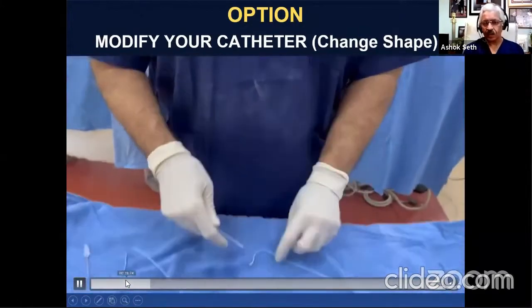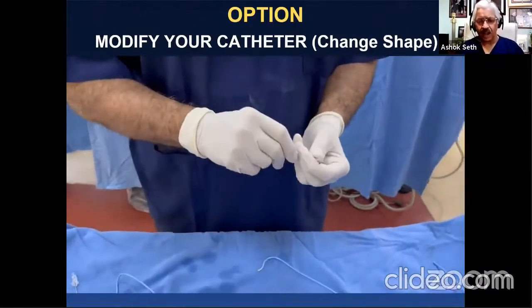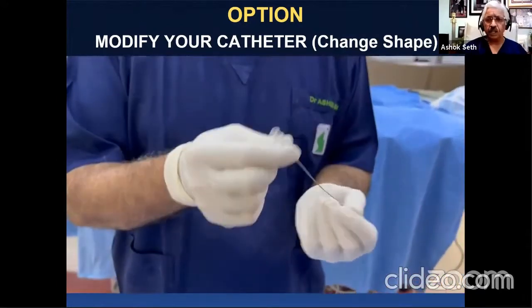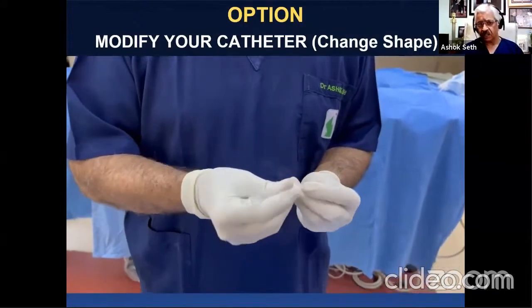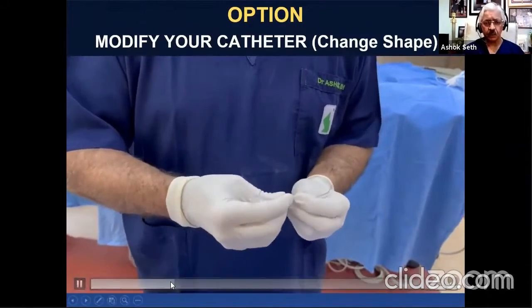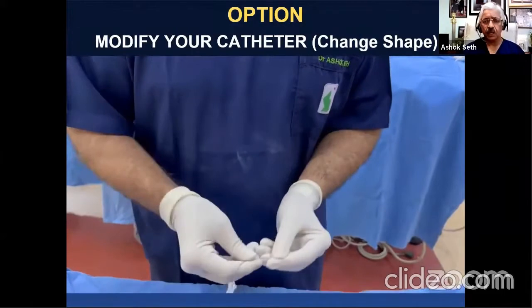I'm here, I've got an Amplatz, and I say I want an Amplatz even greater than an Amplatz 3. I want an Amplatz 5, an Amplatz 6, because the aortic root is so large. So I create a huge curve on that mandrel, and then make it point anteriorly even. So this was, say, an anomalous vessel coming out of a very dilated aortic root.